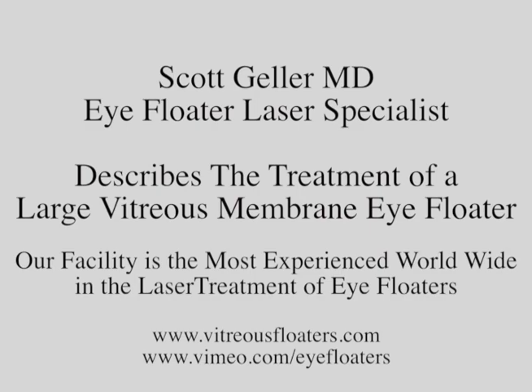I'm going to discuss an interesting case here. This patient had a hyaloid membrane — it's a little different than the average floater. Initially, we always tell the patient if they have a problem, and this patient had a very small cataract. We're using a CGV contact glass from Zeiss and the Zeiss Microruptor Laser, which is the very best on the market, made in Switzerland. I'm looking at the Weiss ring hyaloid opacity here and the thickened hyaloid membrane from a posterior vitreous detachment.